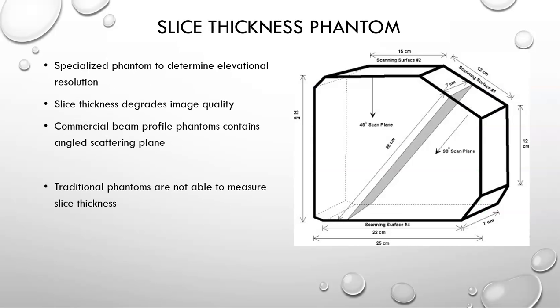Slice thickness phantoms are specialized phantoms to determine elevational resolution. However, as we learned in the lab, you don't have to buy an expensive slice thickness phantom in order to make this measurement.